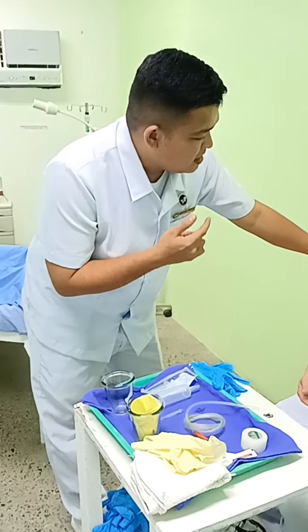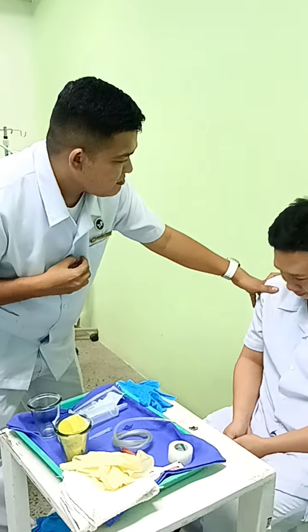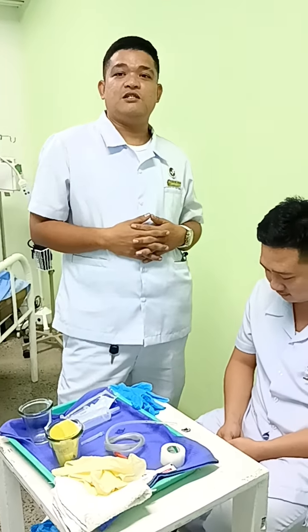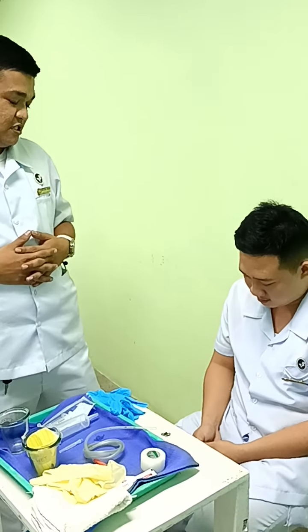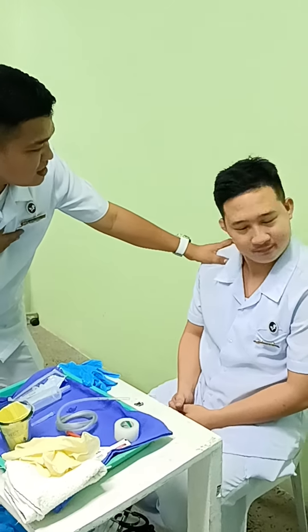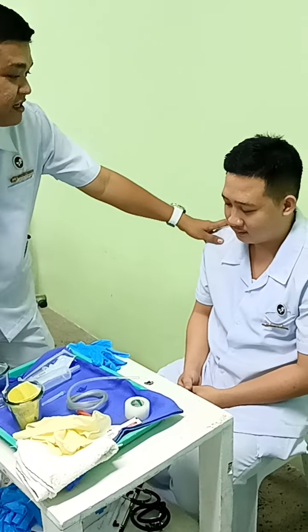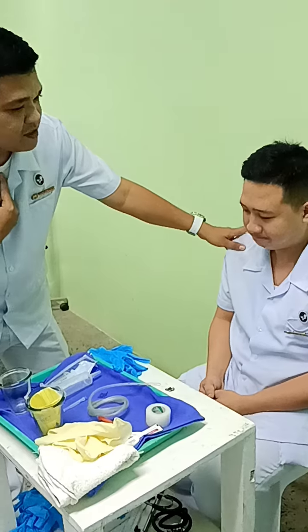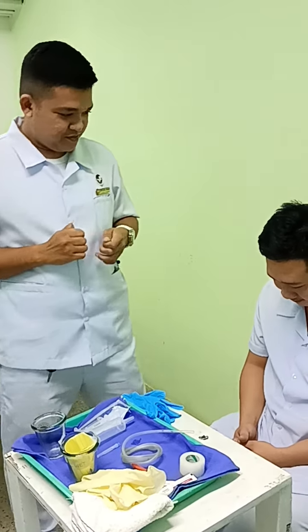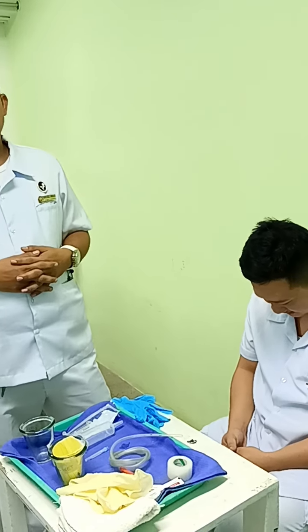Okay, inhale. Next is to assess the patient's medical history, including if he has any unusual bleeding, blood in the nose, or gastric surgery. We also have to review the patient's mental status and gag reflex, then explain the procedure to the patient. Inform the patient how to communicate during the intubation: if you have any discomfort, please do a thumbs up sign, and if not, just point your finger.